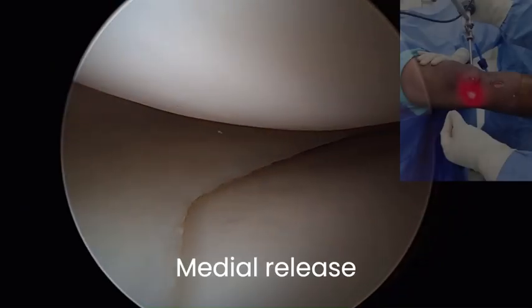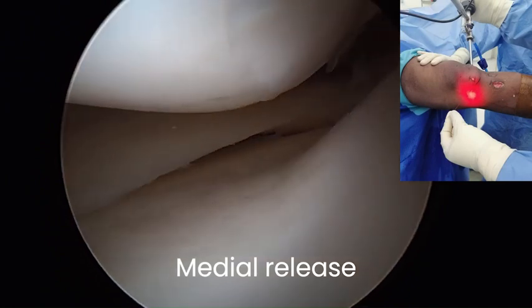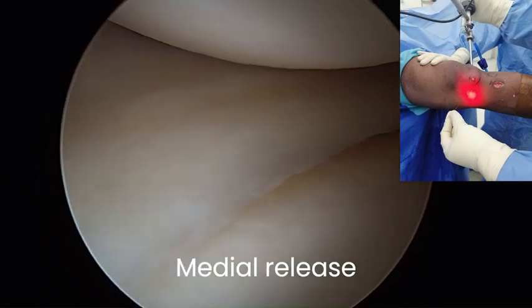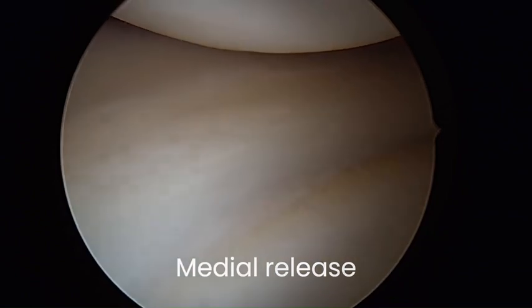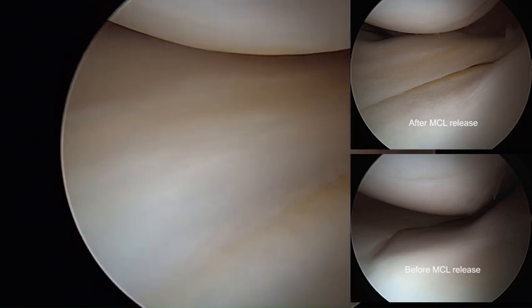Medial release is performed with a knee in full extension and valgus, which is performed by an assistant. A needle is introduced medially over the MCL, slightly distal to the medial femoral epicondyle. The medial collateral ligament can be released percutaneously while the assistant maintains valgus stress. The degree of medial release can be controlled by looking at the amount of medial opening through the arthroscope.